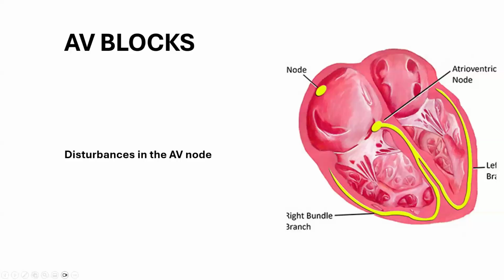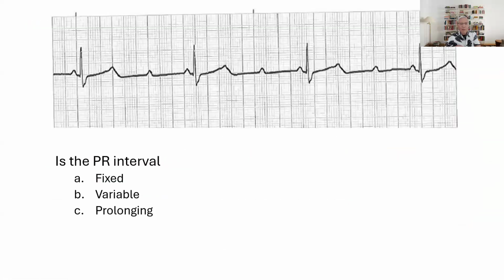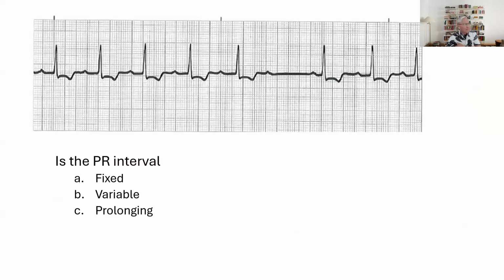Okay. So let me give you another example. Right here. How about this? What's the heart rate? 40. Okay, very good. How about here? 70. Very good.